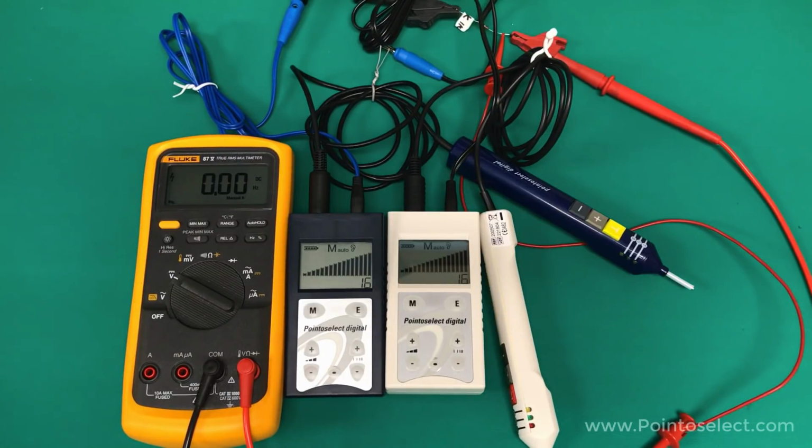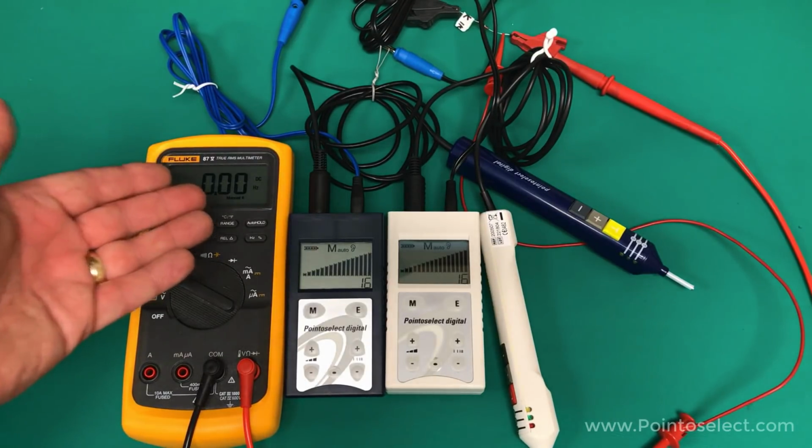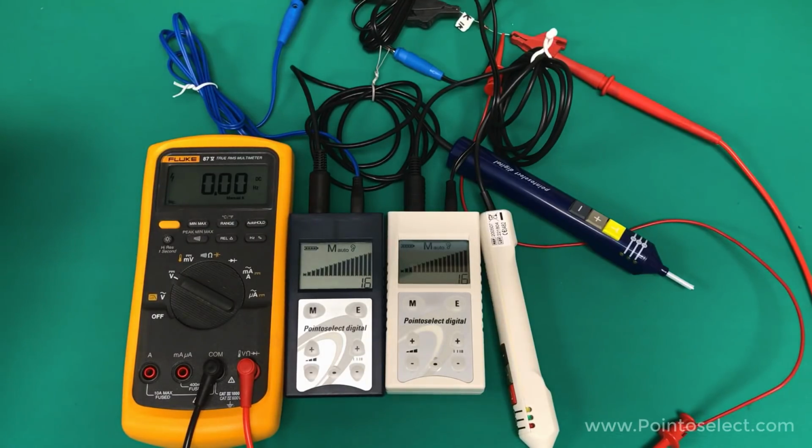That's really the only difference between the units, guys, and we've got the proof right here. They're both highly accurate units, they're both excellent, and I would recommend either one. Since the blue one is available, that's the one I go with.